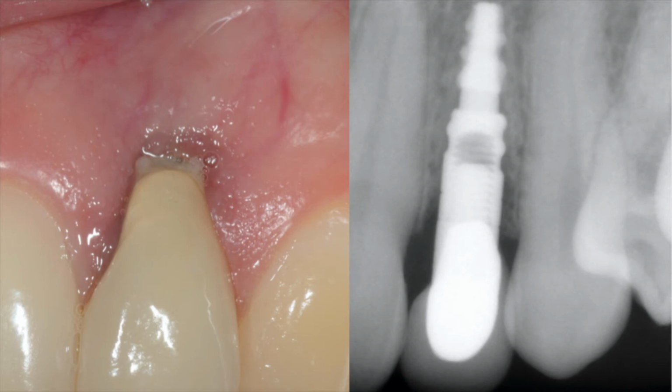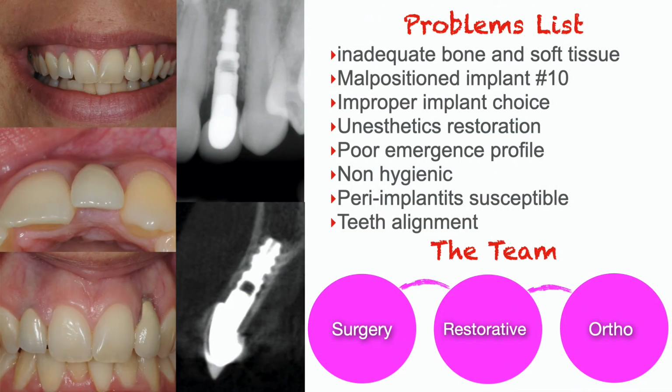The last thing I want you to note, obviously the CBCT is a given, but the periapical radiograph is showing us that she has good interproximal height of bone. So that's good, and I know that predictably I'm going to get a good aesthetic result papilla-wise. So our problem list is pretty clear: an aesthetic problem, poor tissue, thin tissue biotype, and a malpositioned tooth. This is definitely a tooth that is outside of the alignment of the arch, and maybe outside of the arch.